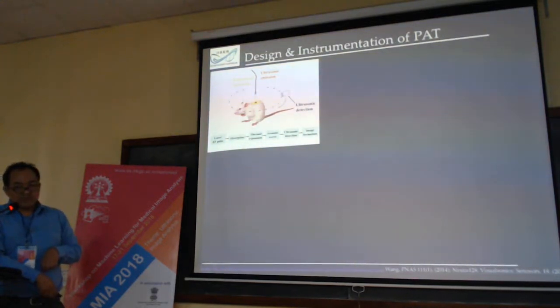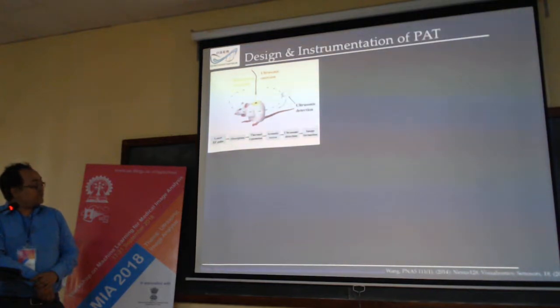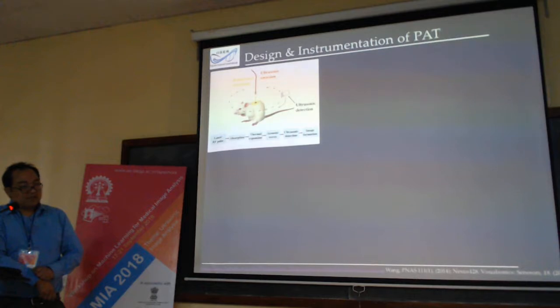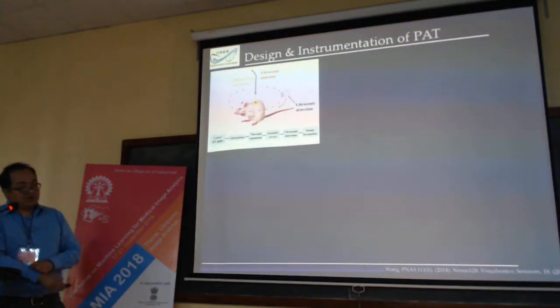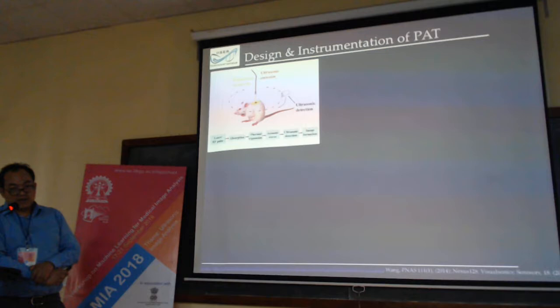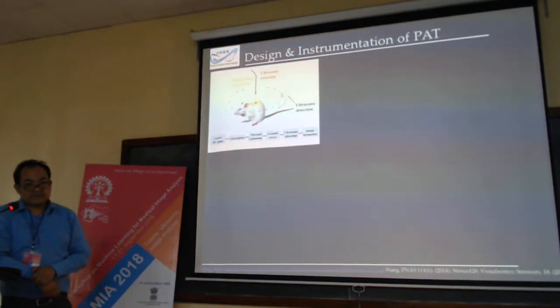So it is time consuming. It cannot give a real-time imaging system. Another thing is that suppose this collection takes 5 minutes, then the incident happening over here, if it is time dynamics, we cannot get it.